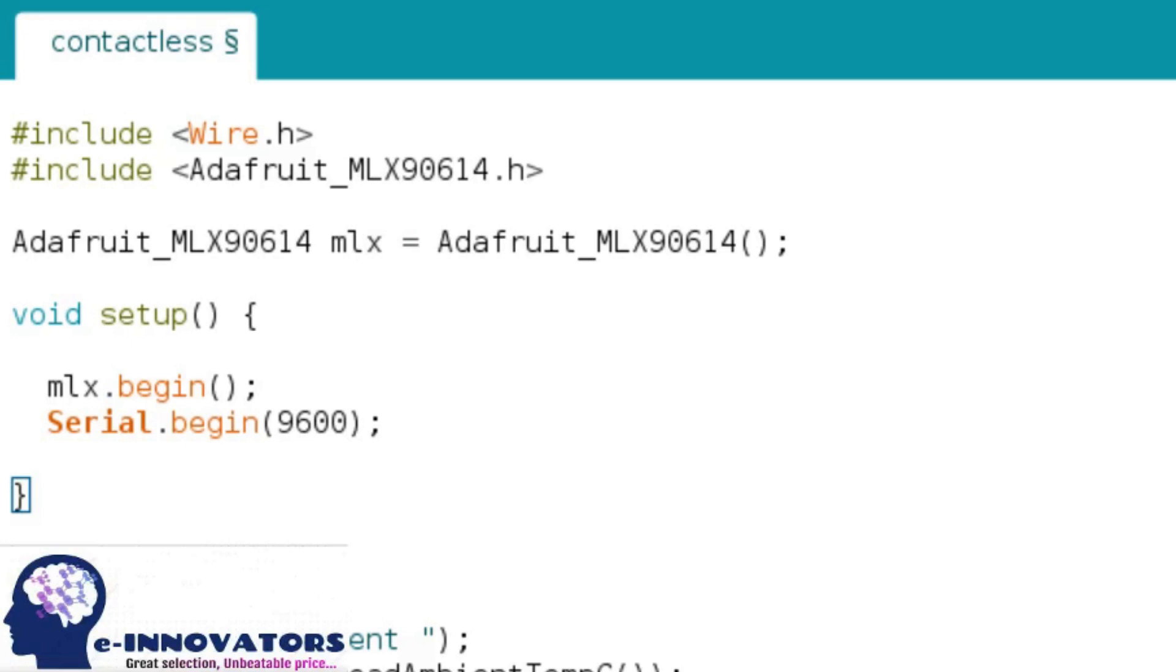Secondly, in the setup function, we have to initialize the sensor mlx.begin and serial monitor serial.begin.